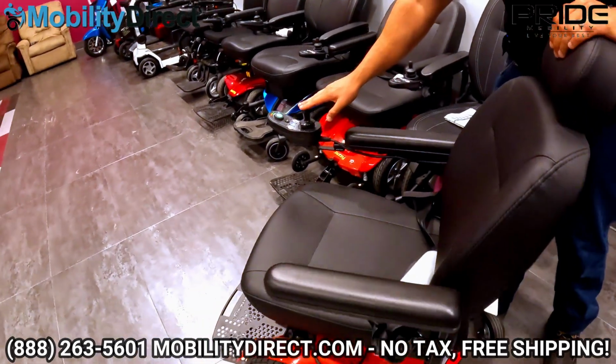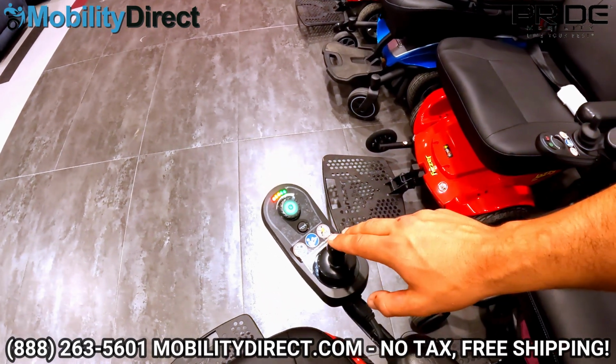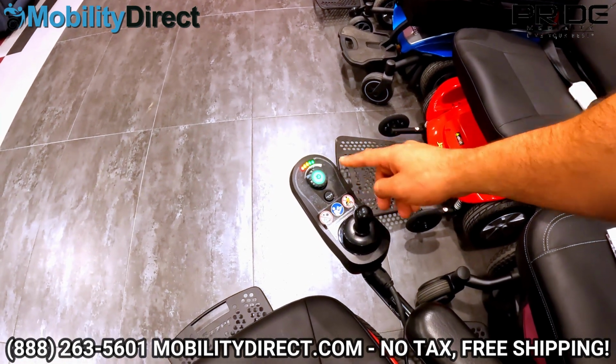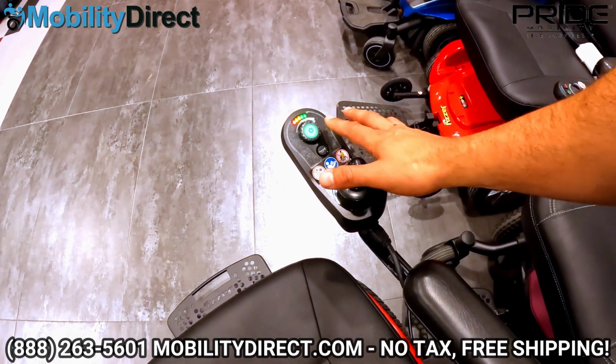You have a standard joystick. It's very responsive. It's throttle sensitive. So if you push forward all the way, it goes all the way to top speed, which you control with the speed knob. So counterclockwise all the way is going to limit the speed and go really slow all the way up. Once you're comfortable maneuvering the chair, you can bring the speed all the way up.